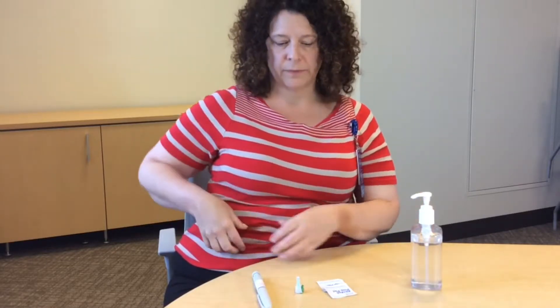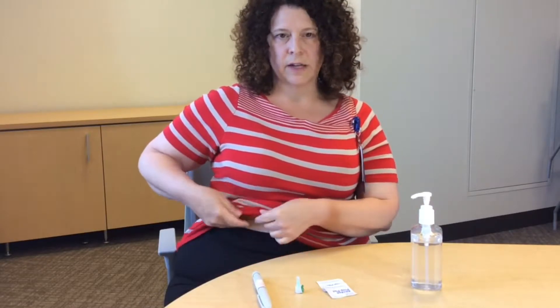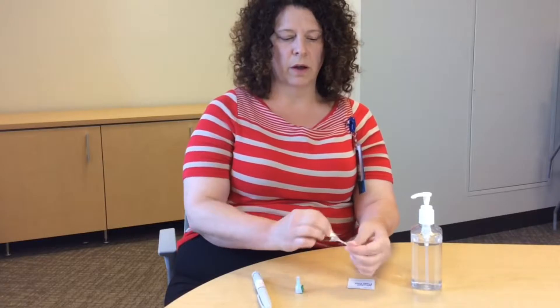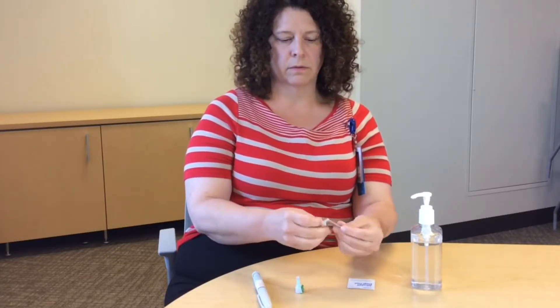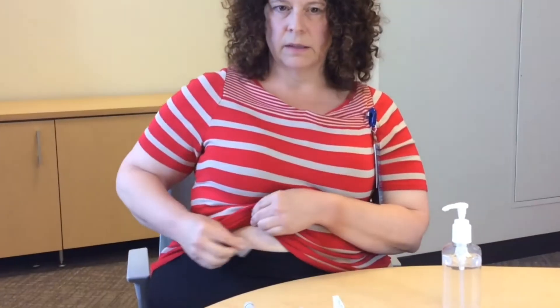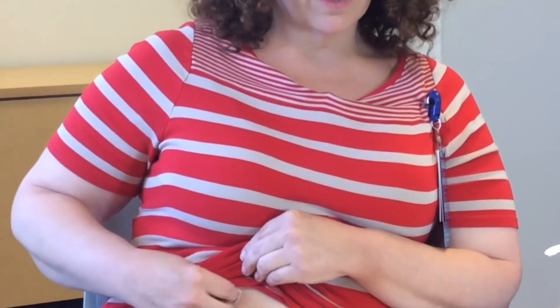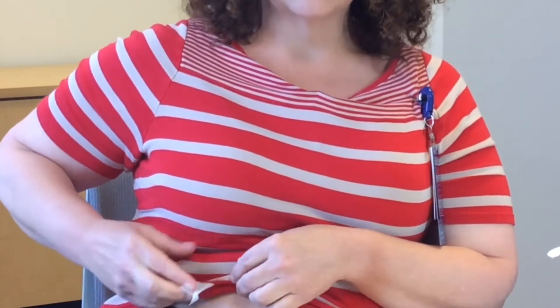You want to prepare your injection site. For me, I've decided to inject on my side. I'm going to take my alcohol pad and clean my site, because you always want to let it dry before you inject — if it's still wet, it will sting a little bit.